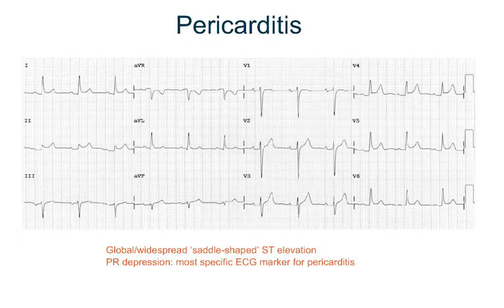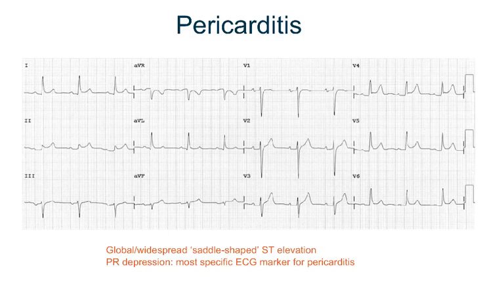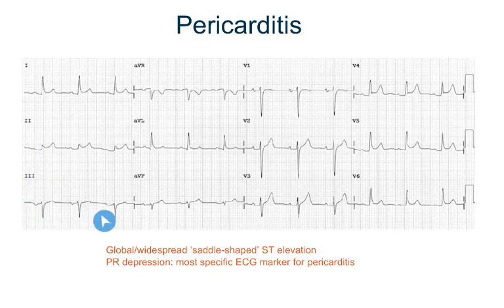In pericarditis, you see ST elevation, but it is not localized to a certain territory — it is global and widespread, like in lead 1, lead 2, V4, V5, and V6. The shape of the ST elevation is saddle-shaped or concave. The other marker is PR depression, which is the most specific marker for pericarditis. You can see it in lead 1, lead 2, and even in V4, V5, and V6.